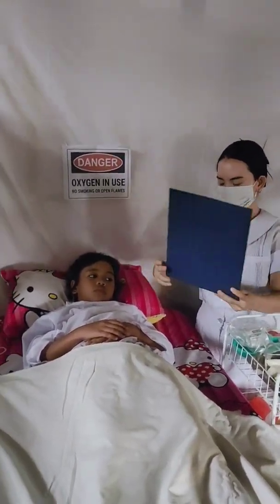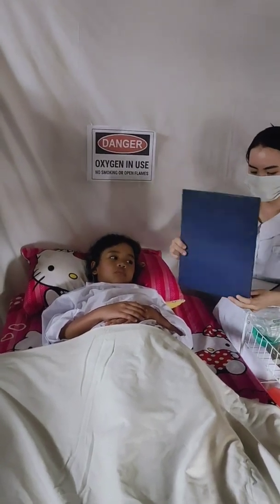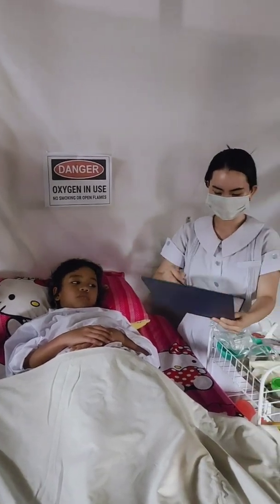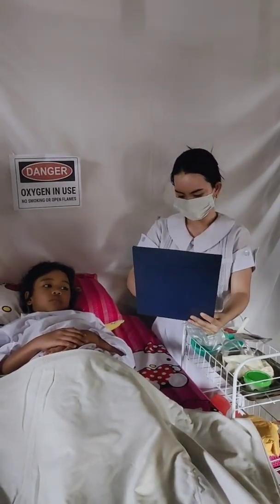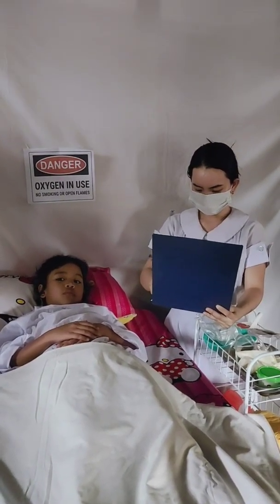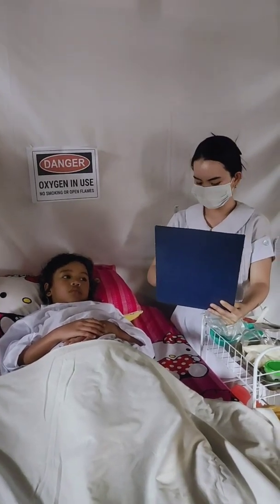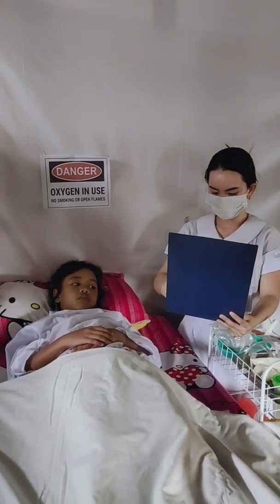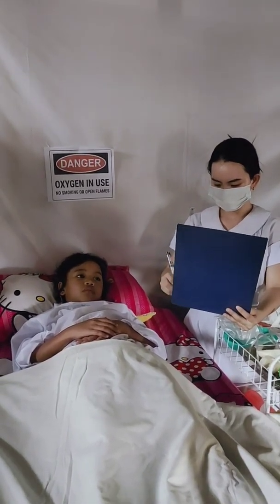Last procedure is the documentation. Record in the nurse's notes at the beginning and end of the nursing shift and include in the shift report the following. Oxygen therapy through nasal cannula. Respiratory assessment findings: before is 12 breaths per minute and after the therapy is 18 breaths per minute. Patient is cyanotic before. After the therapy, the patient is not cyanotic. Fast chest movement is observed before and after the therapy, normal chest movement is observed.